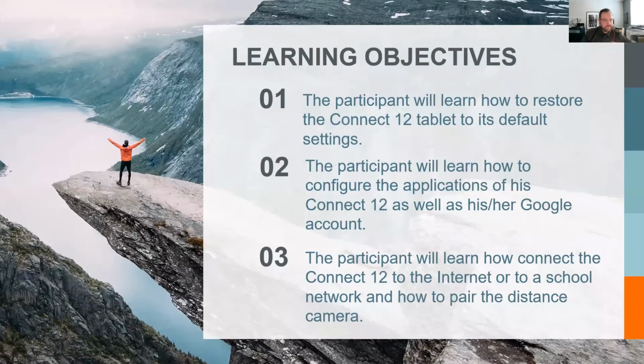Our learning objectives today. The first learning objective: the participant will learn how to restore a Connect 12 tablet to its default setting. This can be very useful at the beginning of the year when you're sharing the Connect 12 inside a school, and multiple students can use these devices, and you want to reset the whole tablet for a new student. Again, this is for if the tablet was used previously by a student and you want to share this tablet with a new student. This is the procedure on how to reset the whole tablet.